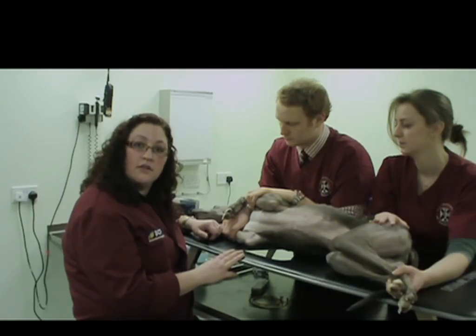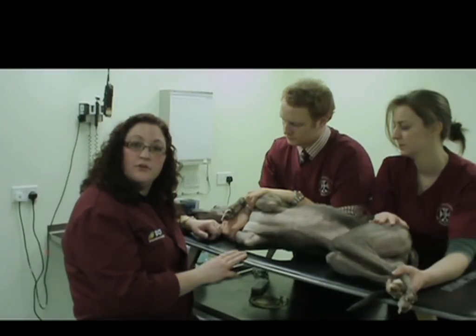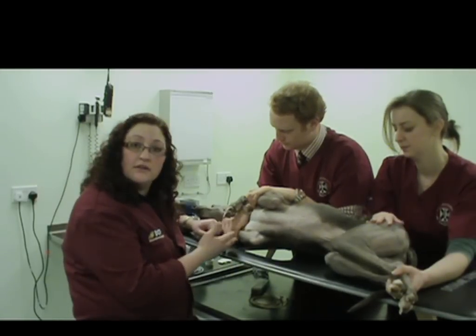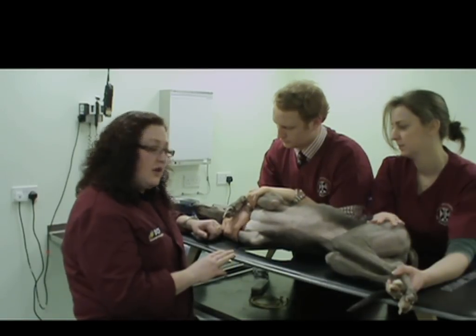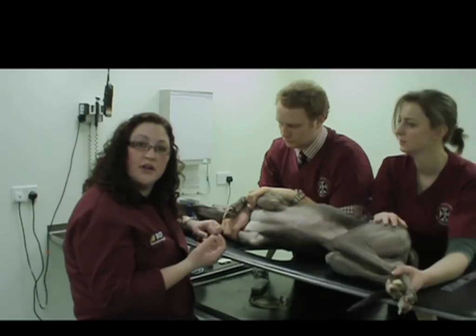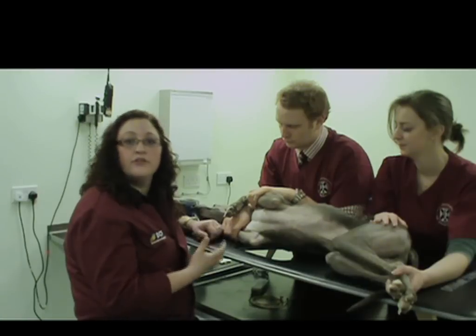Another thing that the echo exam will be able to tell you about, in comparison to a standard radiograph, is it will let you visualize what the heart is actually doing in terms of contractility, heart rate, and heart function. You'll be able to distinguish the myocardium apart from the blood pool, and you'll also be able to evaluate structures such as the valves and the great vessels.